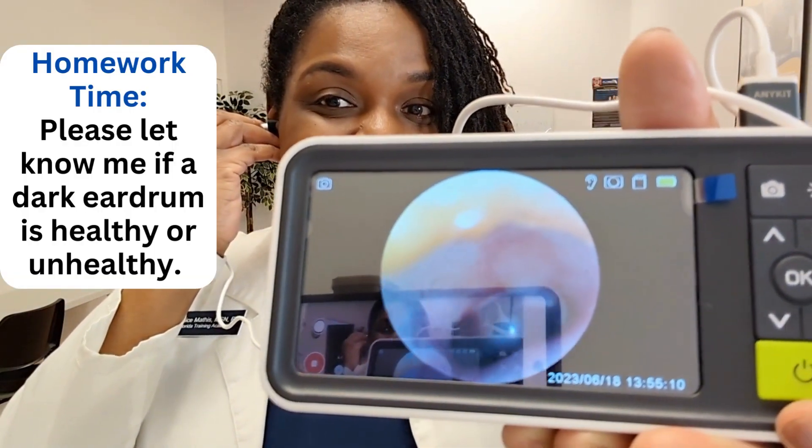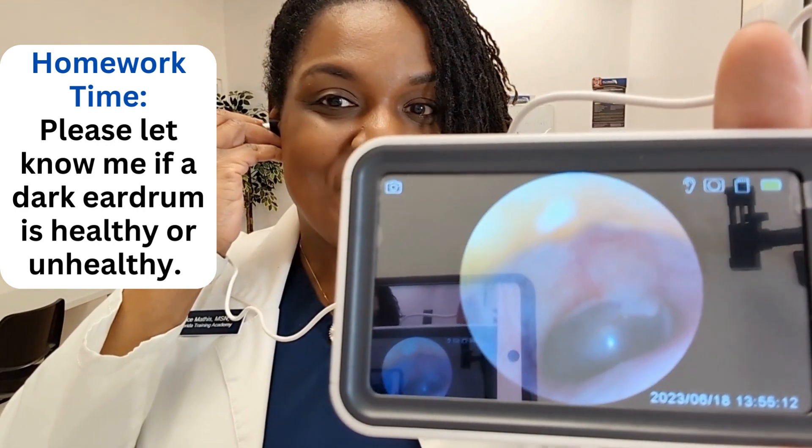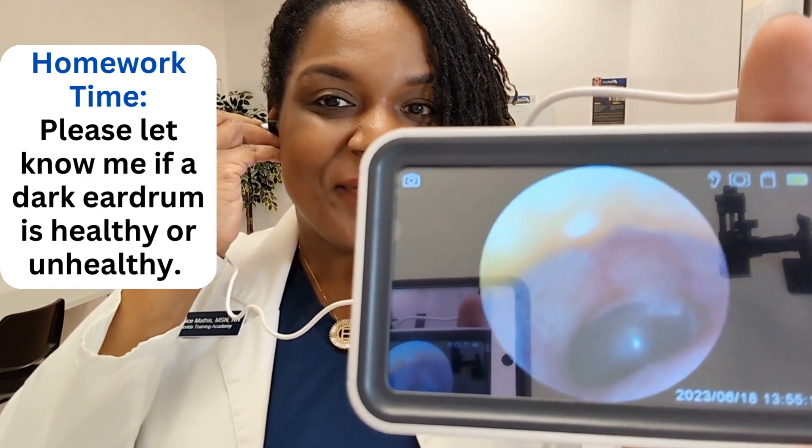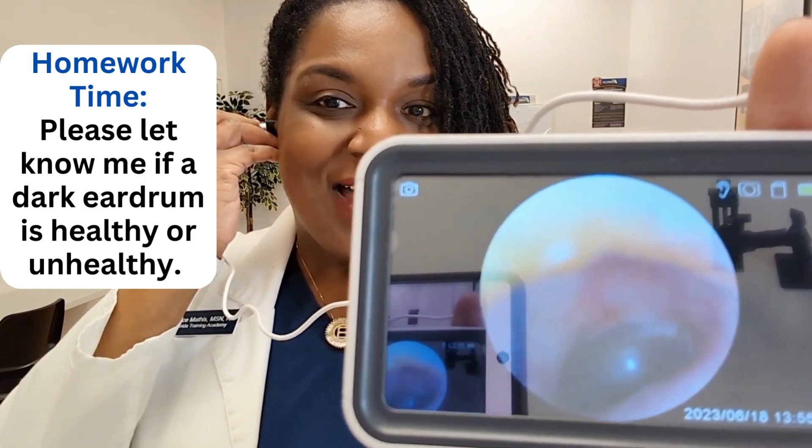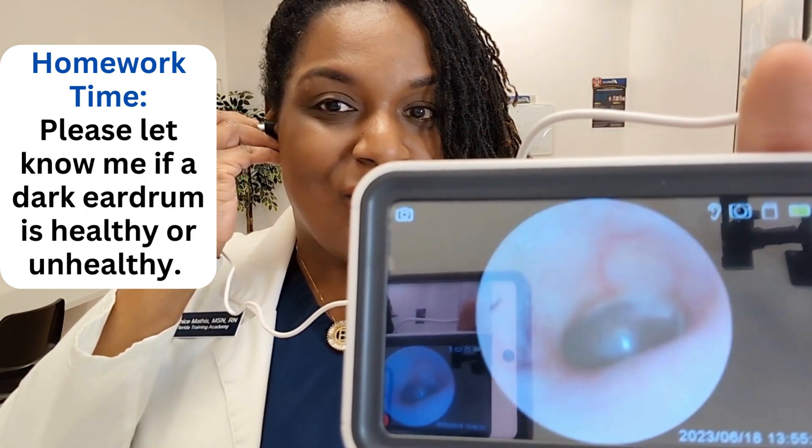It's intact. Can you all see the tympanic membrane? There may be a little bit of light flashing off because I'm showing you from a camera while using my camera — but everybody, this is so cool.